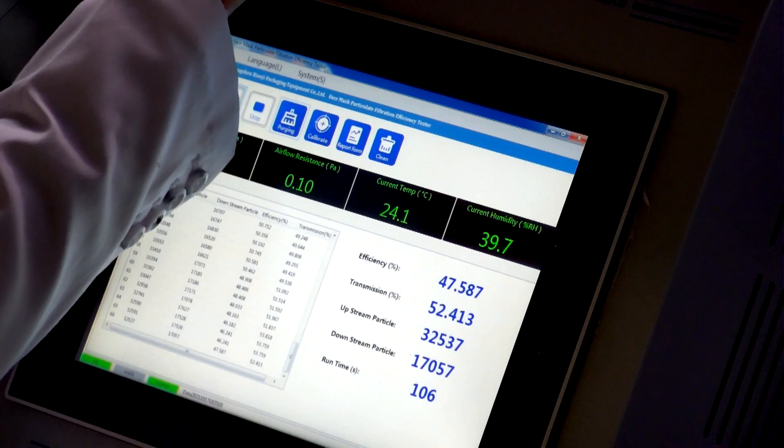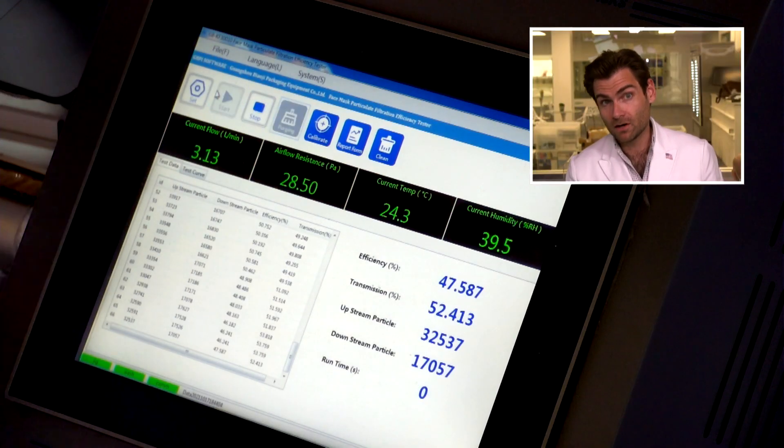This is a PFE machine — particulate filtration efficiency machine. We're doing the ASTM test here so you don't have to. This will tell you what percentage your masks will filter.